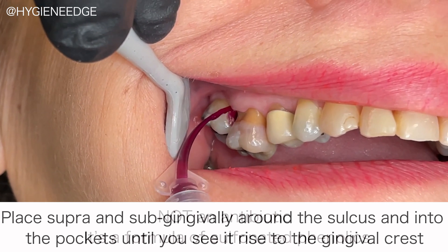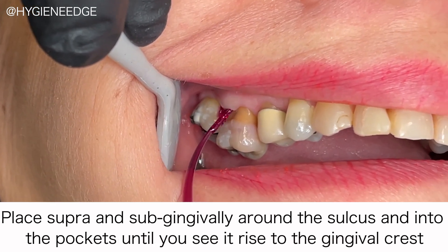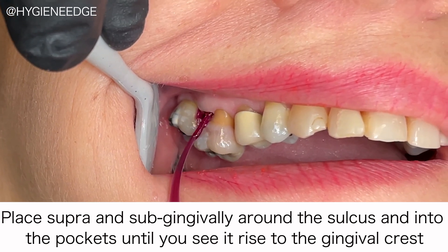Then you're going to place Hybenex supra and subgingivally around the sulcus and into the pockets until you see it rise to the gingival crest.